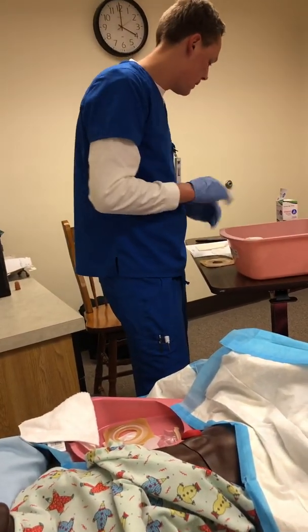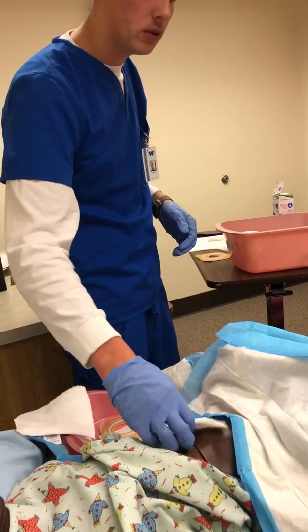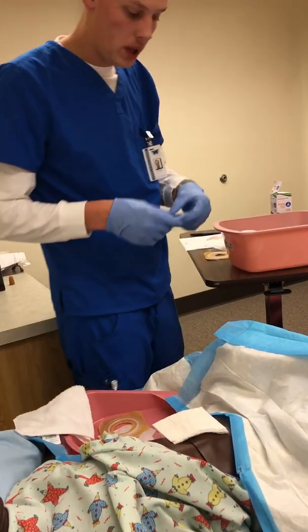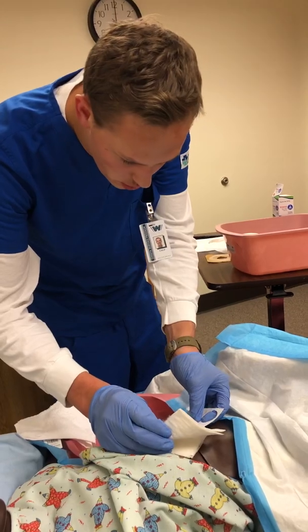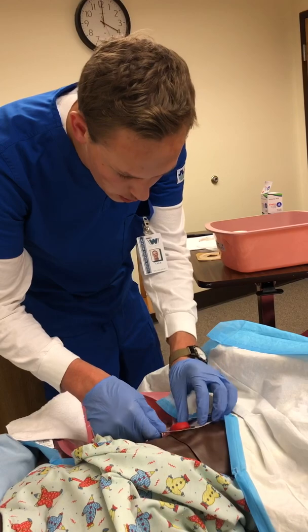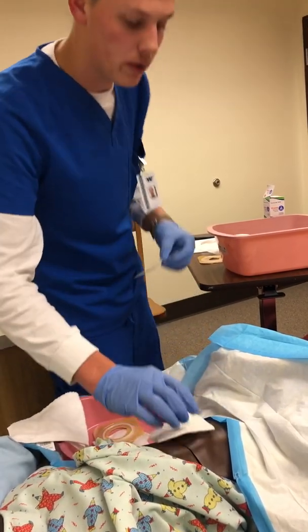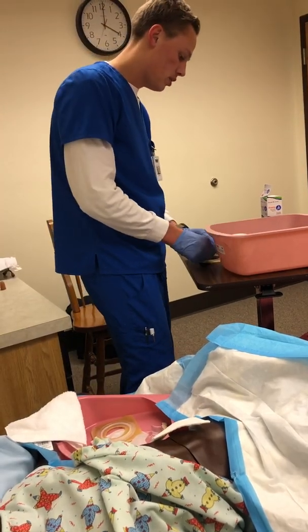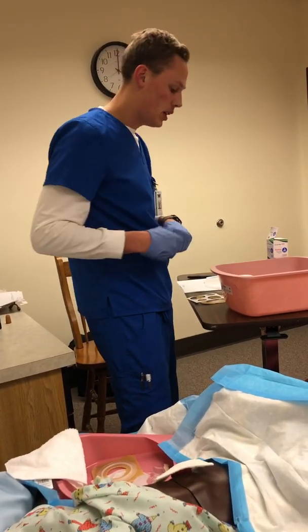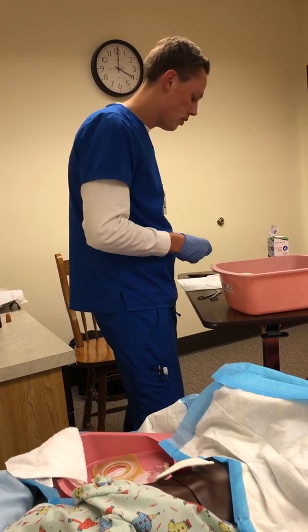And then once it was cleaned, I would cover with a 4x4 and then measure it to the correct size. So you want a 1/16 to 1/8 of an inch border. So we're going to do this one, cover it back up, and we're just going to measure that to my faceplate. For video purposes, I've pre-cut this one just to save time. So I've got it cut out.